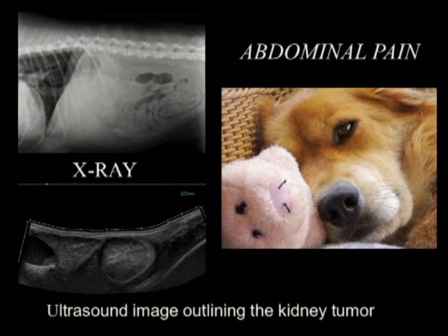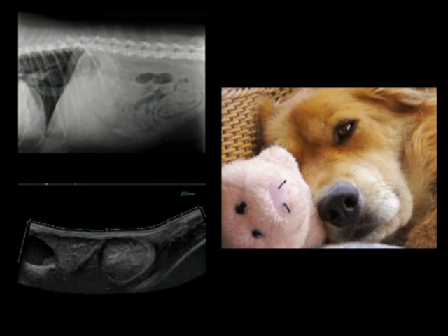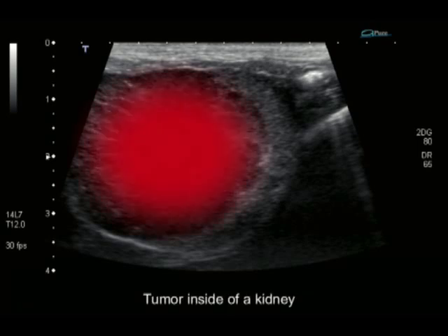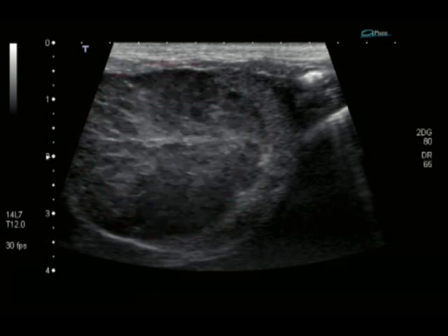In this older dog with abdominal pain, an x-ray couldn't clearly give us an answer. But on ultrasound, we could clearly see that there was a mass in the left kidney.